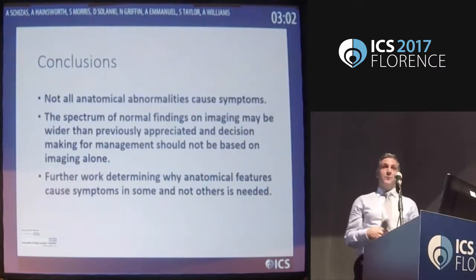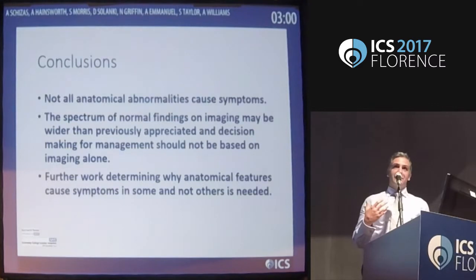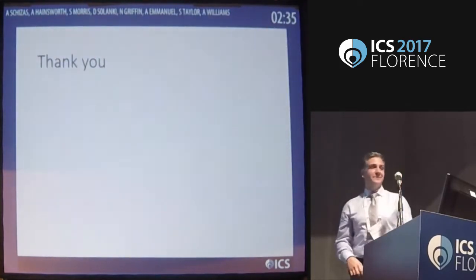And it's important from this to remember that finding a cystocele, rectocele, enterocele, or poor defecatory technique doesn't mean it's a symptom and a cause of their pelvic floor pathology. We would like to obviously try and recruit more people and do more numbers, but I think that's quite difficult. And we're now looking at those patients with pathology and comparing the two investigations together to see what findings we find and see if it matches. Thank you.